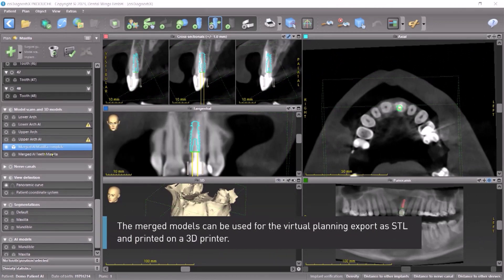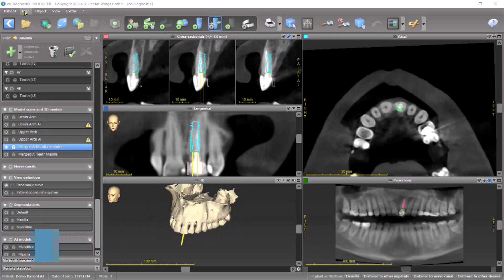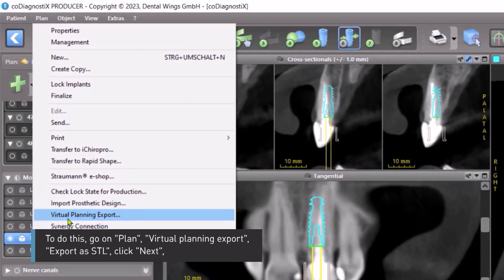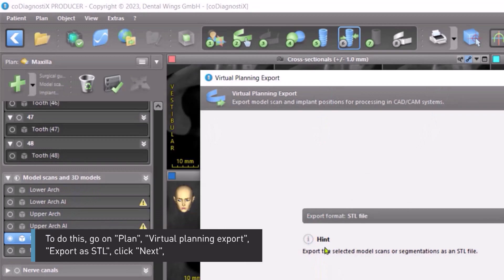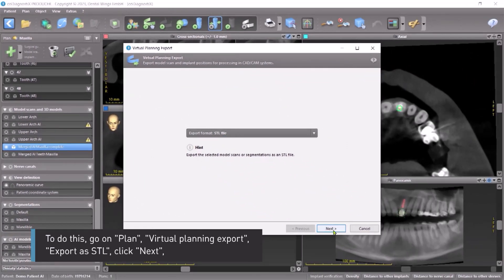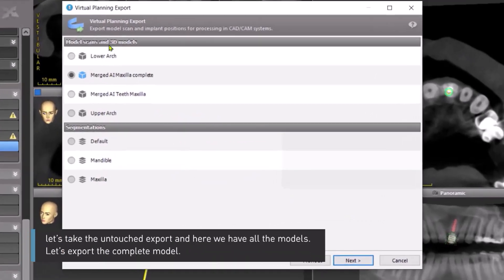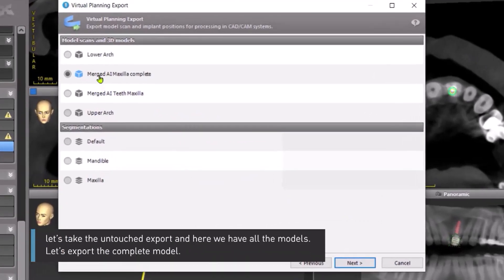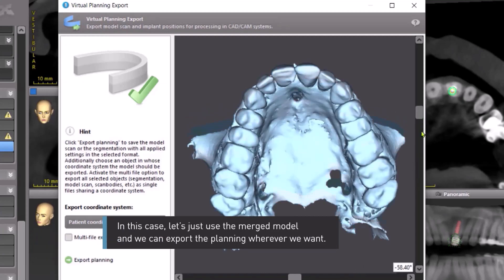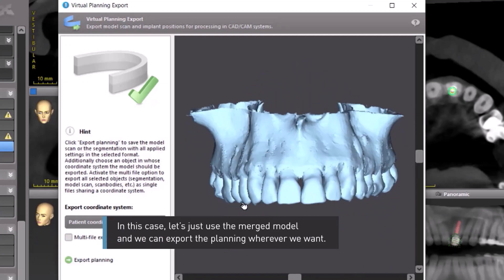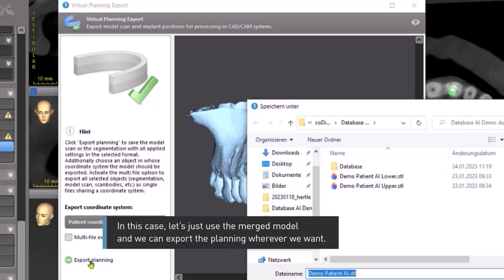The merged models can be used for virtual planning export as STL and printed on a 3D printer. To do this, go to Plan, Virtual Planning Export, Export as STL, click Next. Let's take the untouched export — here we have all the models. Let's export the complete model. In this case, let's just use the merged model, and we can export the planning wherever we want.